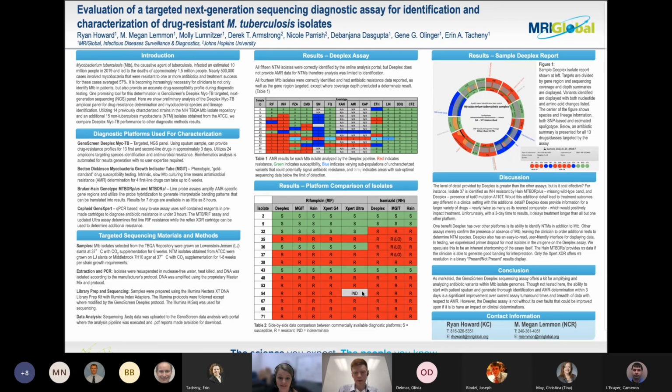Yeah, so we compared not only to standard, maybe more cost conscious diagnostics. I think the Gene Expert is something on the order of $9 or $10 a cartridge, subsidized by foundations like the Gates Foundation or other stakeholders. This sequencing isn't as cost competitive, but it also provides a whole lot more information, we think, than some of these more limited diagnostic means.